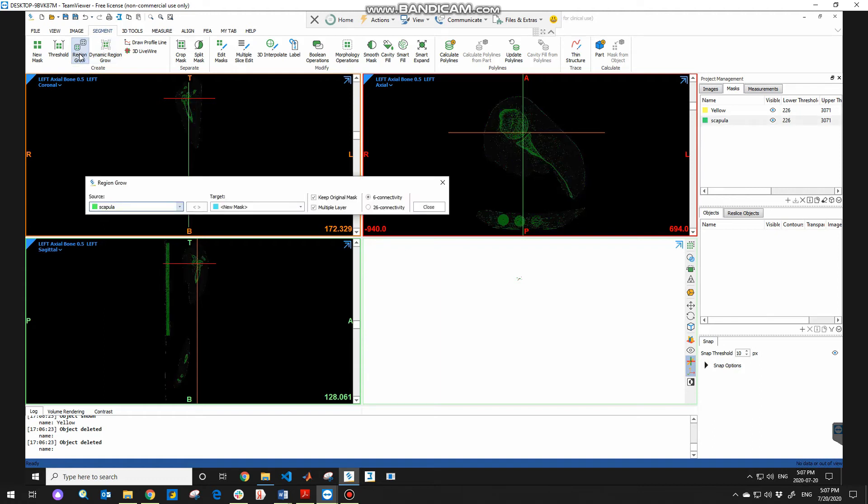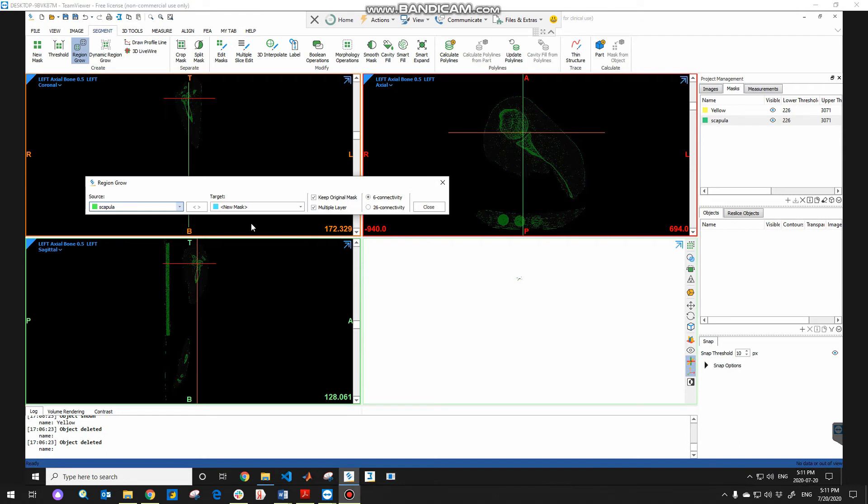The region grow window will pop up. As you can see, you need to choose the source and target. So basically, in this case, the source includes all bone and you just want to segment the scapula. The target will be the blue new mask, which is the scapula. You need to check the keep original mask for possible future inquiries and also check the multiple layer too.